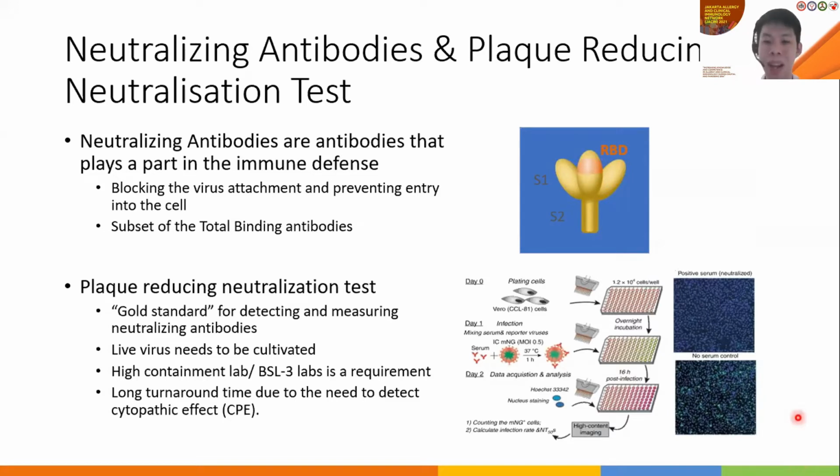It also requires a highly skilled laboratory technician, as the execution and precision of cell seeding and measuring of cells to culture the cells and viruses is a delicate process, and it may be prone to contamination. So a highly skilled technician is required for this process as well.